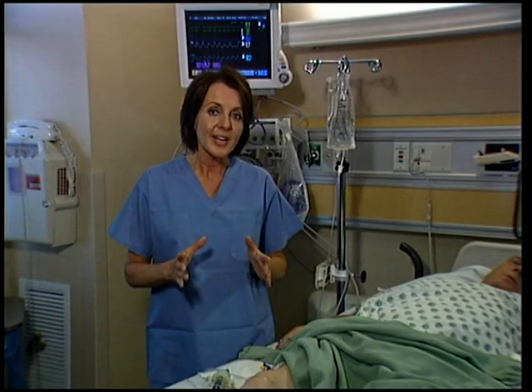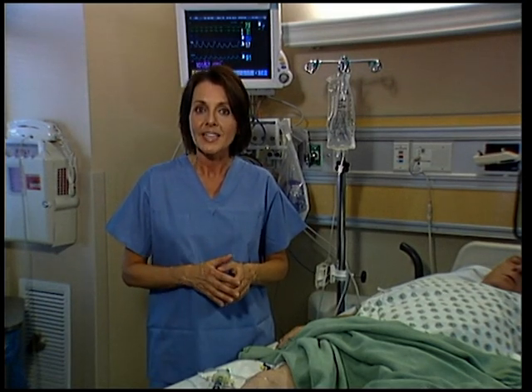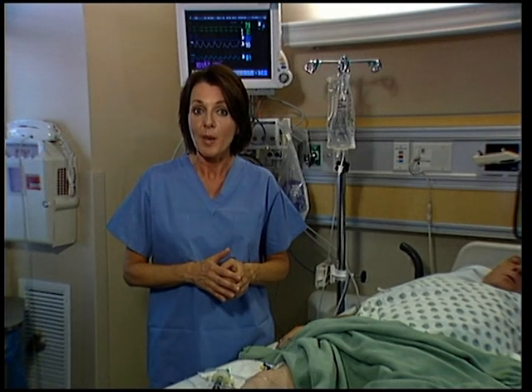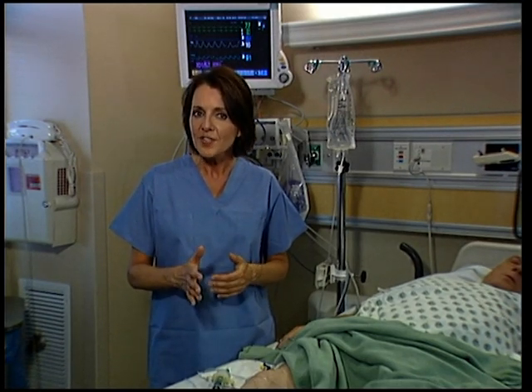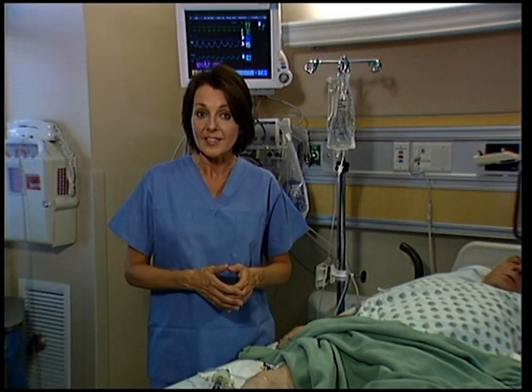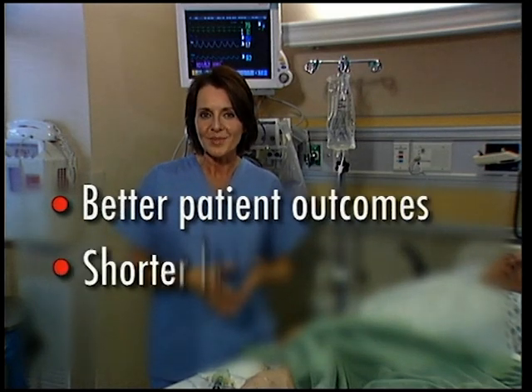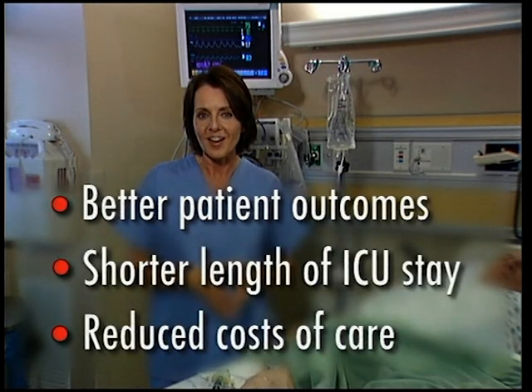By monitoring all high-risk patients early and often, you will be able to detect intra-abdominal hypertension before the patient develops abdominal compartment syndrome. This allows you to intervene and change the patient's course, initially with medical interventions and at times with surgical interventions. The results will be better patient outcomes, shorter length of ICU stay, and reduced cost of care.